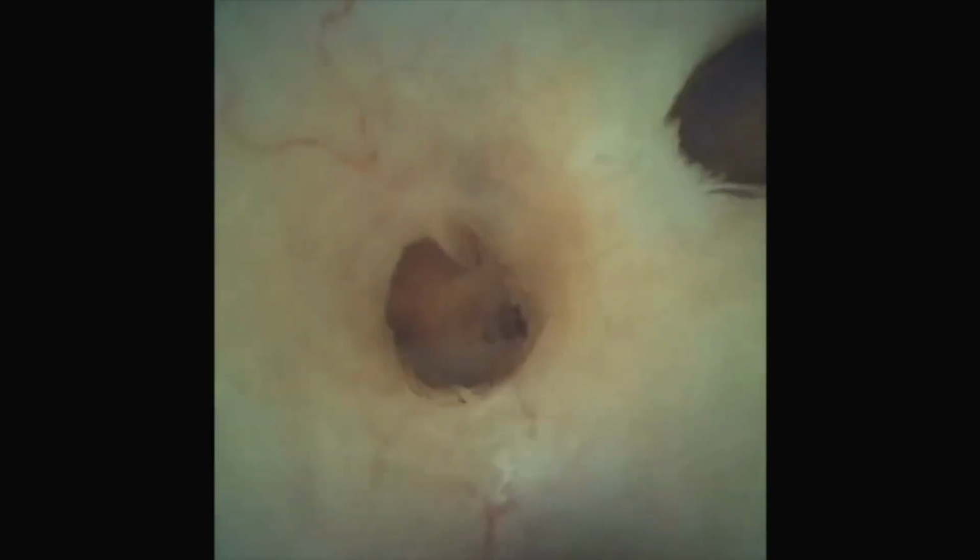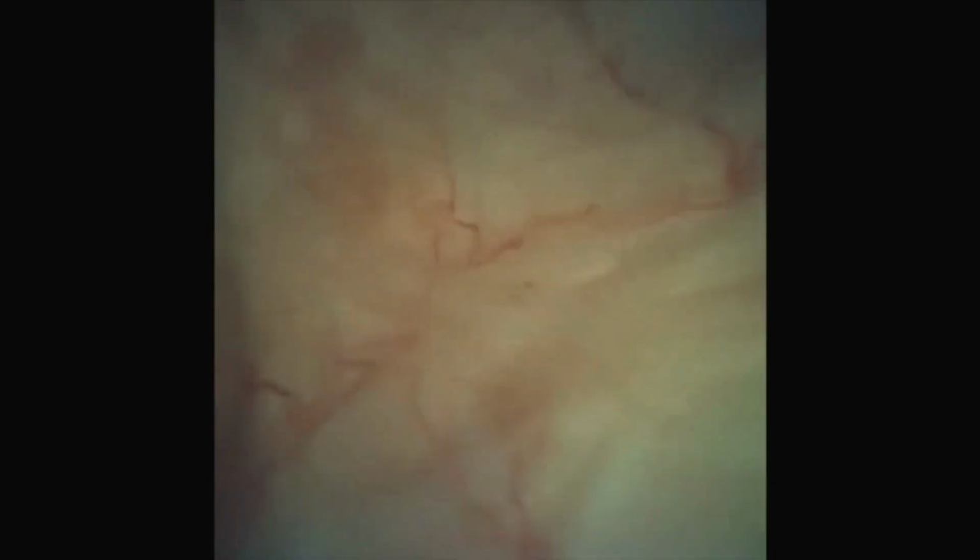So we're slowly making our way up the ureter because the purpose here is to make sure that there's no disease in the ureter. Once we reach the kidney, we explore the kidney. We turn our scope. You can see that one-to-one torque ability of this scope is excellent, making it easier to see all the calyces. We're visualizing calyx by calyx, making sure we map the entire collecting system and make sure we don't miss any lesions. And you can see this whole procedure took just a couple of minutes here.